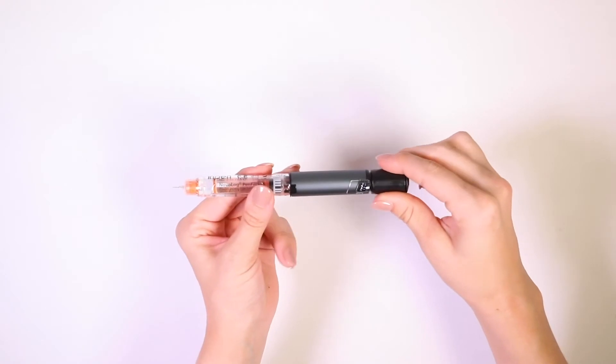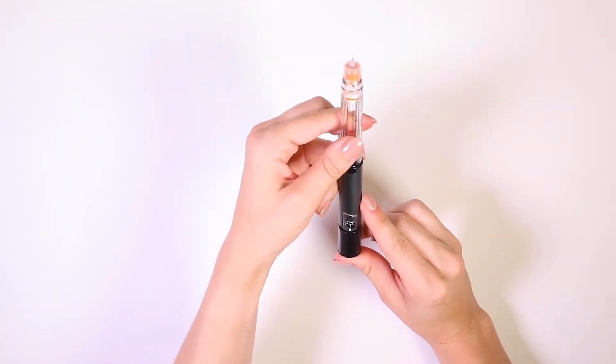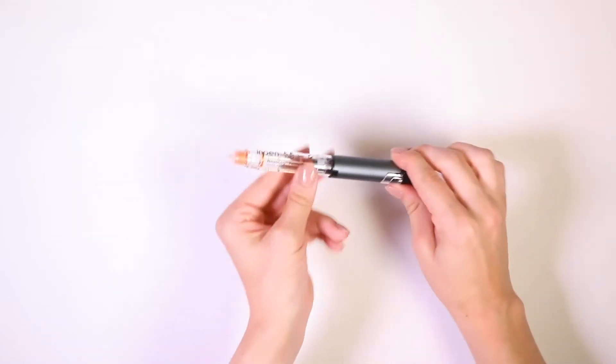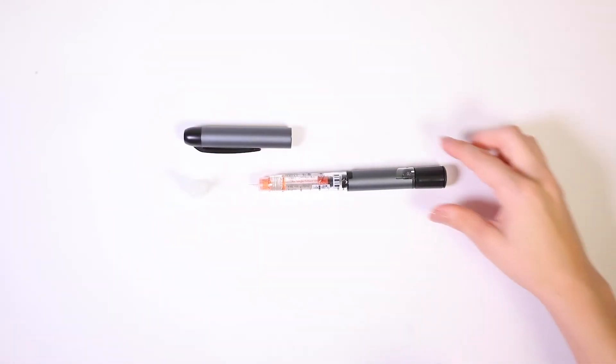To prime the InPen, turn the knob until the window shows two, then hold the InPen with the needle pointing up. Press the button until the window shows zero. Repeat until insulin comes out of the needle.